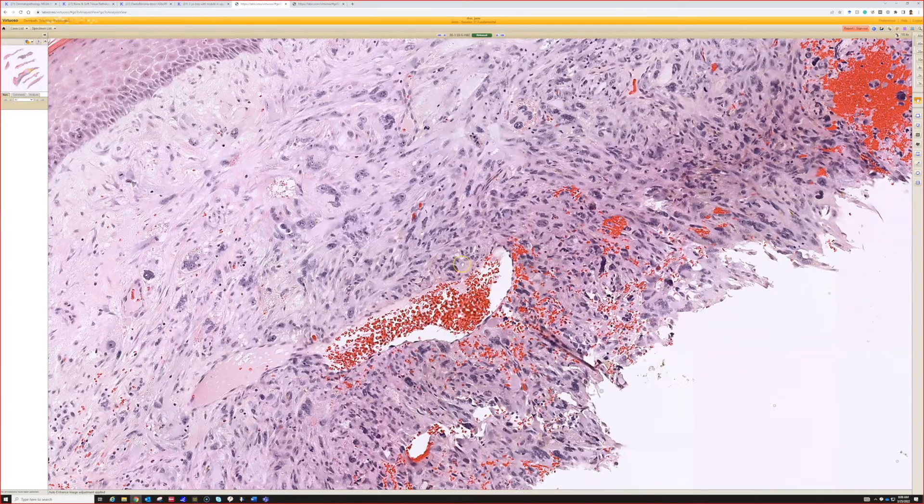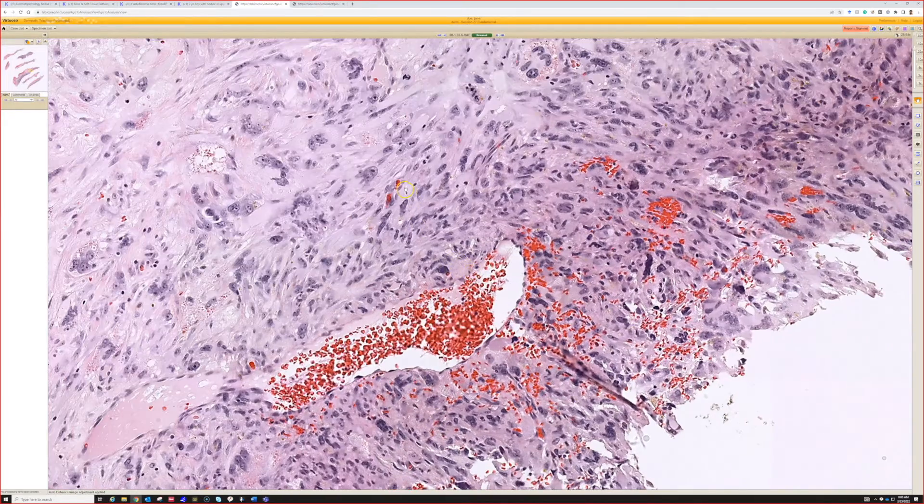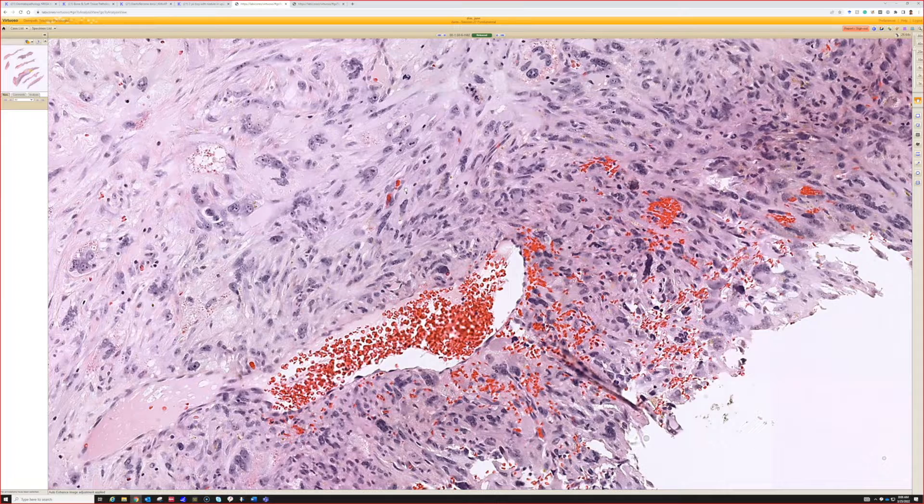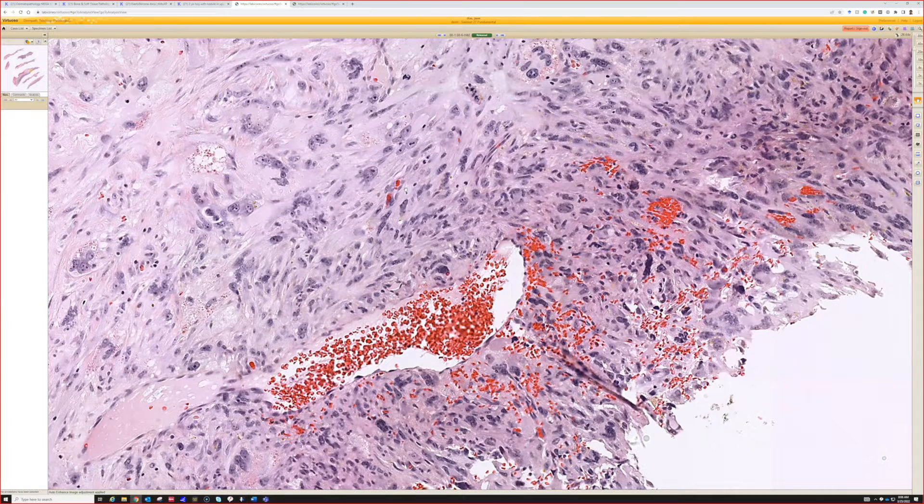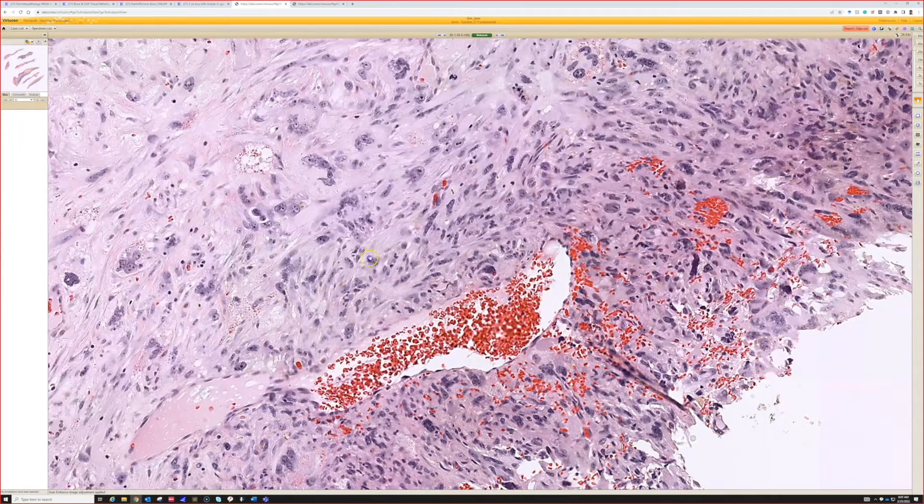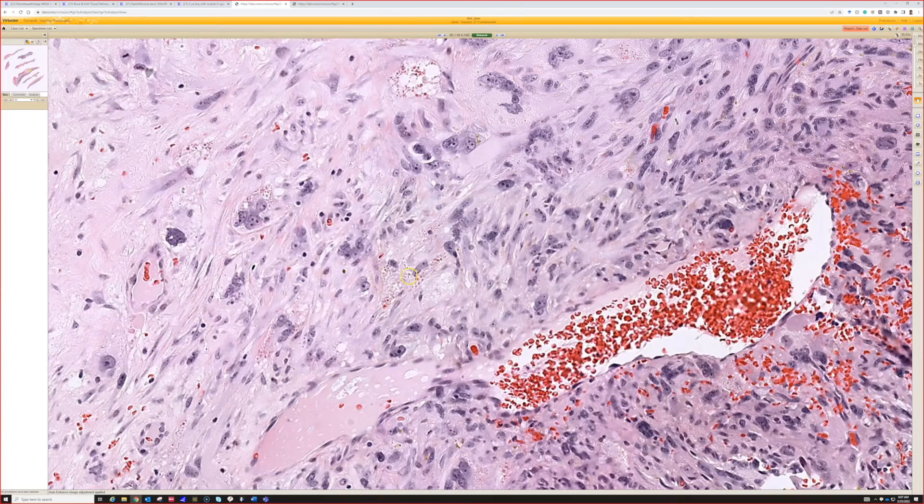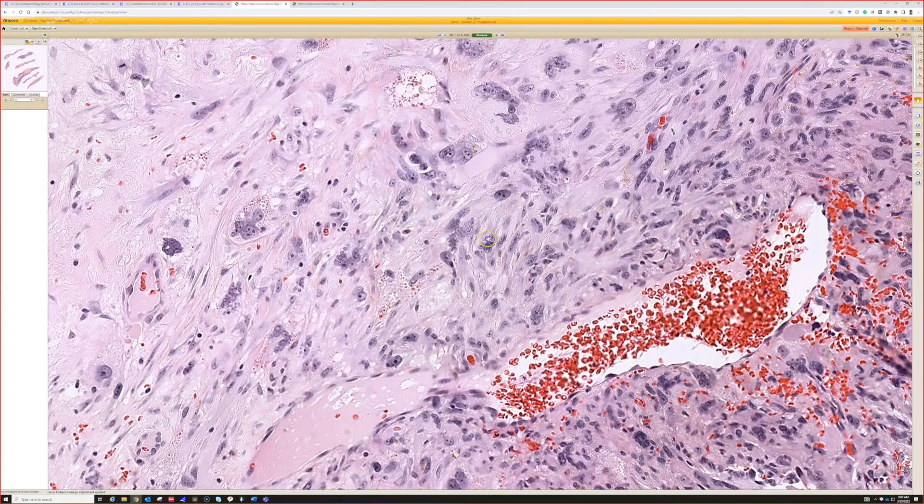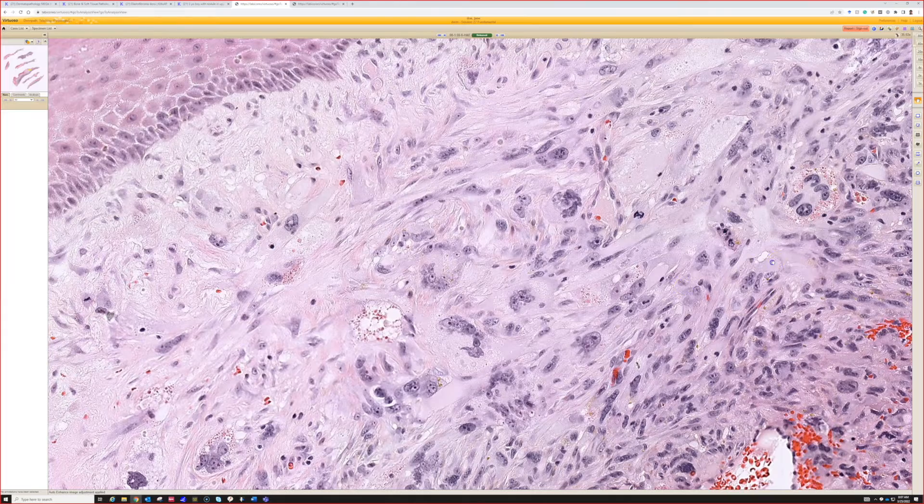And you see ugly cells that basically look like a high grade sarcoma, super pleomorphic and ugly. Sometimes they have some foam, which is where the name atypical fibrous xanthoma came from, but I see many of these that don't have any foam. This is a little bit foamy here, but I don't think that's a requirement anymore.